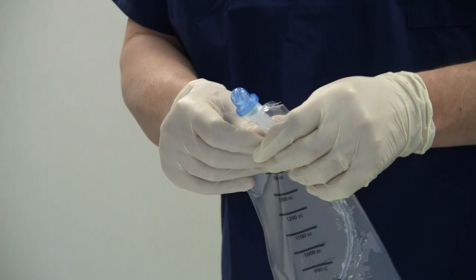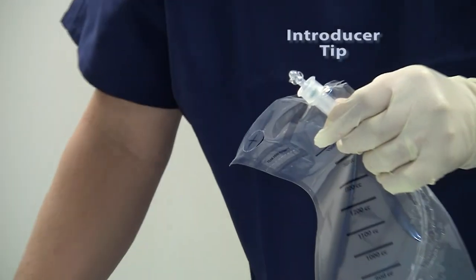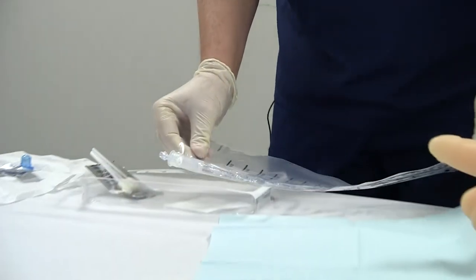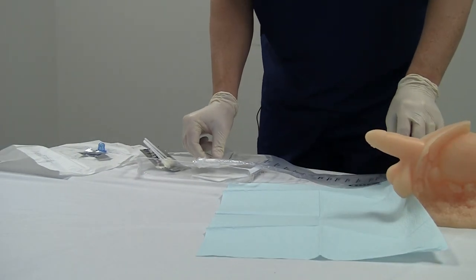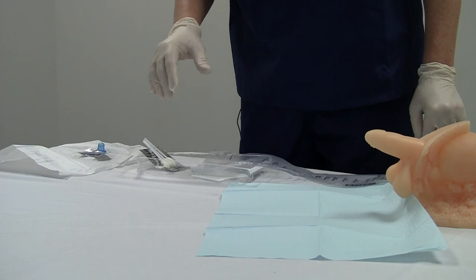Now, I'm going to remove the cap and expose the introducer tip. And I'm just going to discard the cap, set it aside there. And I'm going to place the closed system catheter also back in my sterile field with the introducer tip inside the tray so that, again, it remains sterile. So now we're ready to go to the patient.